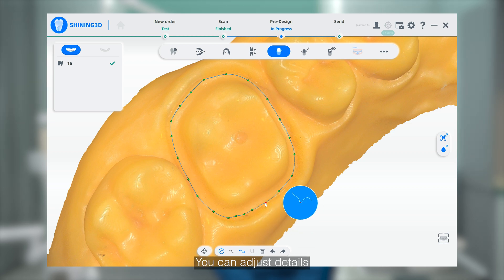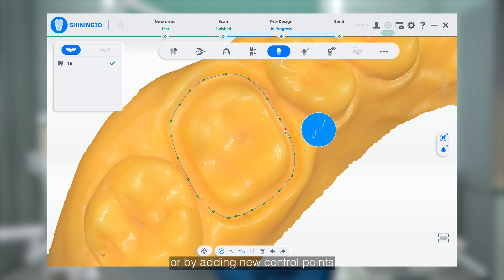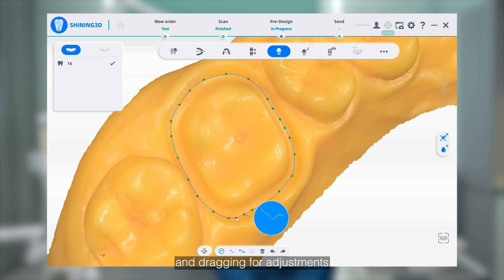You can adjust the details by dragging the green control points on the Marginal line, or by adding new control points directly to the drawing line for adjustments.